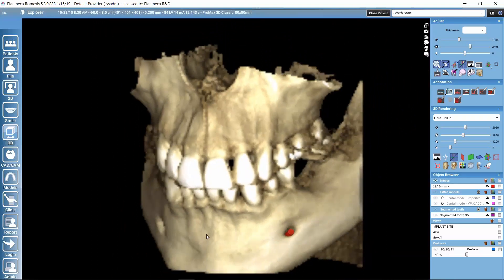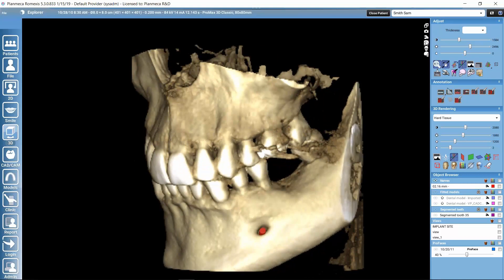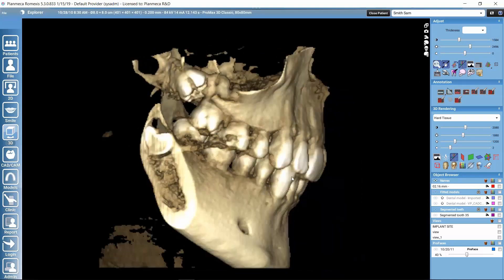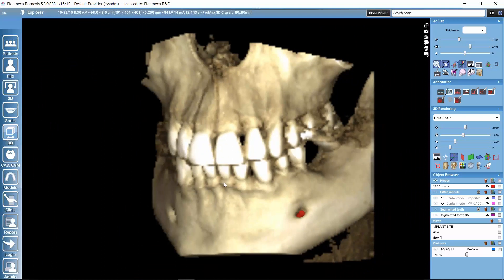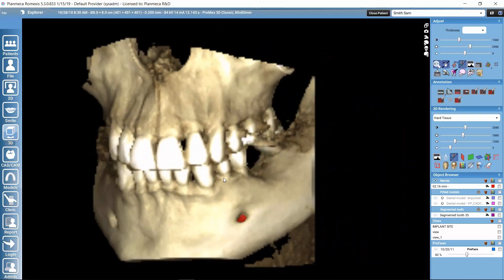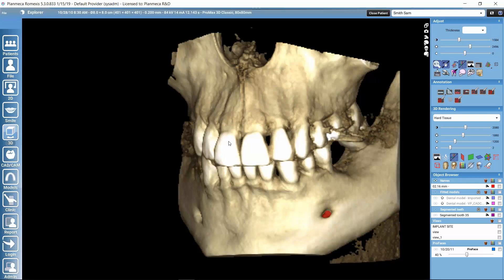Keeping the left mouse button down allows you to move the volume around. In version 5.3, there are also quick orientation buttons to view the data from left, front, and right with one click. To pan the volume, keep the mouse wheel or both mouse buttons down and drag. The right mouse button can be used for centering — right-clicking on a point, such as an incisor, will center the volume on that point in the 3D rendered view.